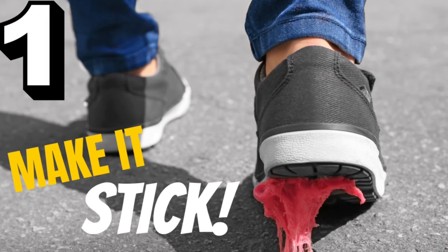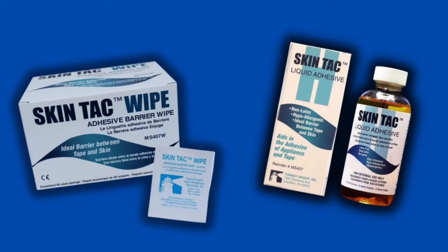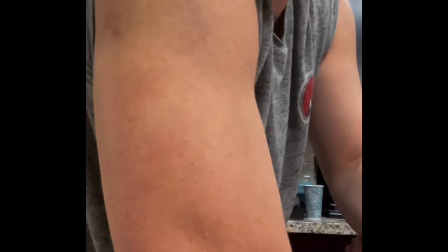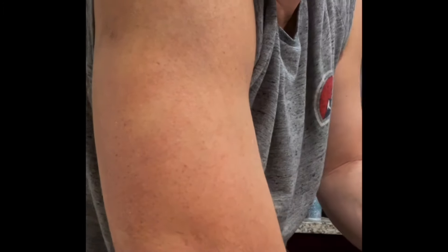Number one: make it stick. My last and most important tip is to use something called SkinTac — a liquid adhesive you apply to the skin just before putting on your Libre sensor. It really should be included in the box with every sensor, as it's a necessity to make sure the sensor stays on the full 14 days. It comes in a bottle or individual wipes. To use it, clean the arm with alcohol as normal, let it dry, then apply the SkinTac. It takes about 30 seconds to dry — make sure it's nice and tacky before applying the sensor.